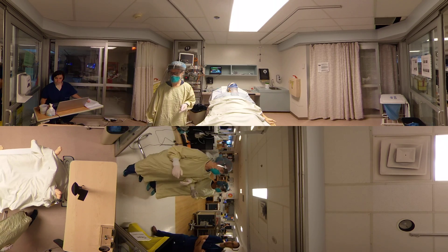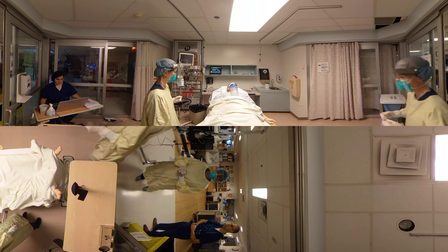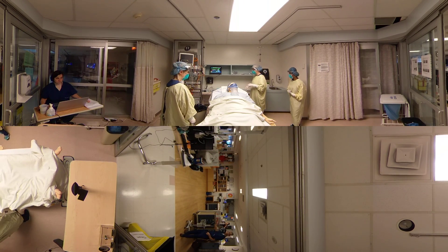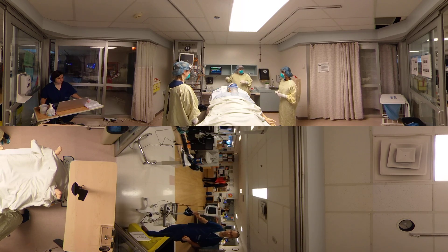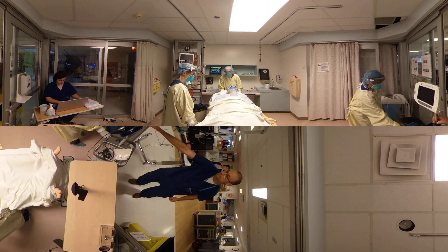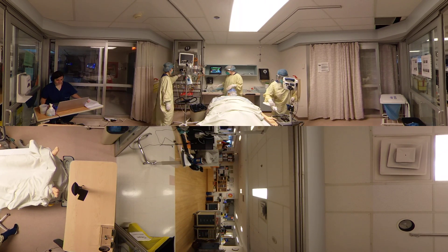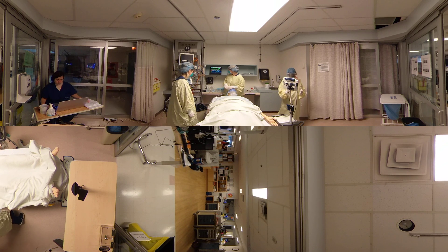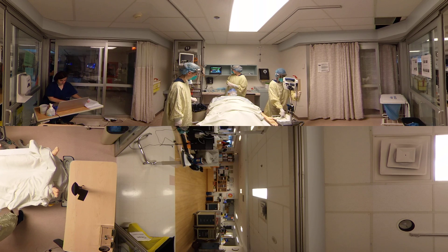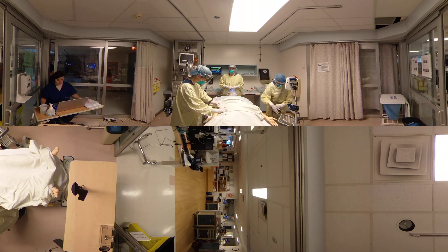We're going to need some intubation equipment. Is there a glide scope in the room? I didn't go and get that. Did you get us the glide scope? Prahima, I see that there's some intubation and premedication already as well as an airway kit. We have suction, we have a face mask. We have a circuit set up with CO2 and a filter in line. So the patient is tachycardic, she is hypotensive, she is desaturating.